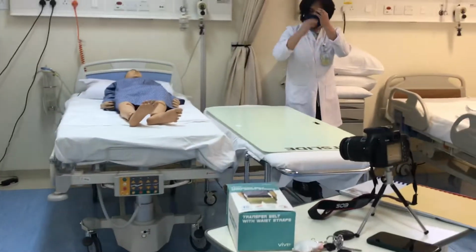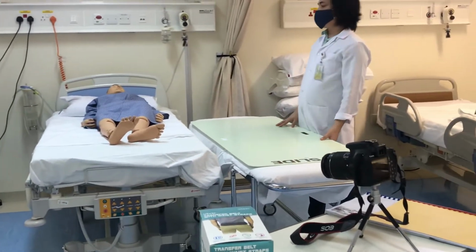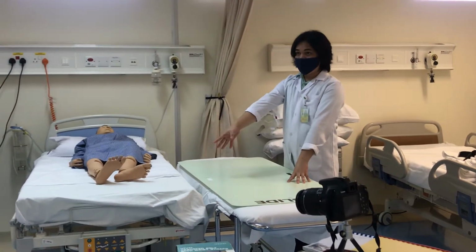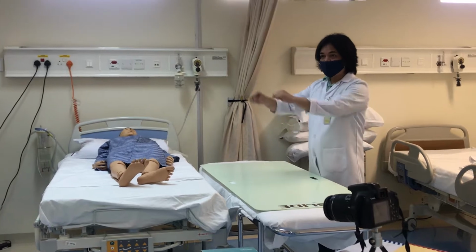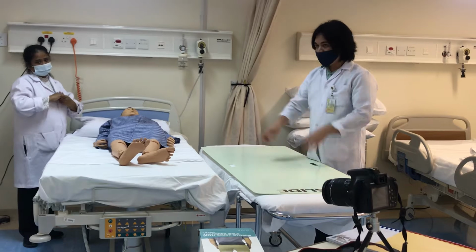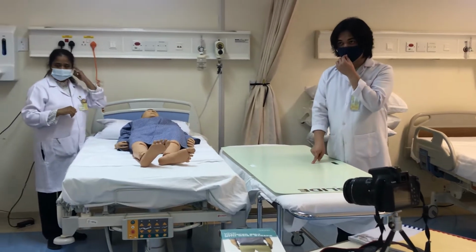Okay, now, since you're going to transfer the patient on the stretcher, you need to decide which bed should be higher, the stretcher or the bed. Just consider the gravity. If you're going to transfer the patient to the stretcher, the bed should be higher than the stretcher, correct?